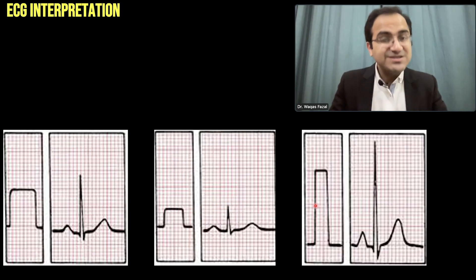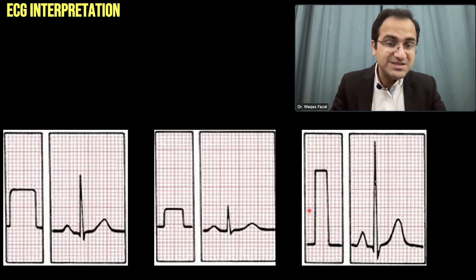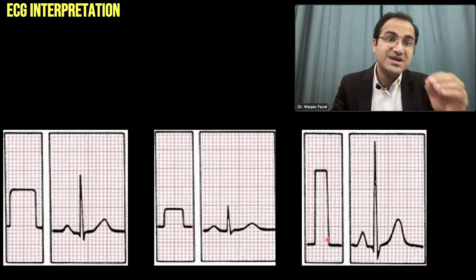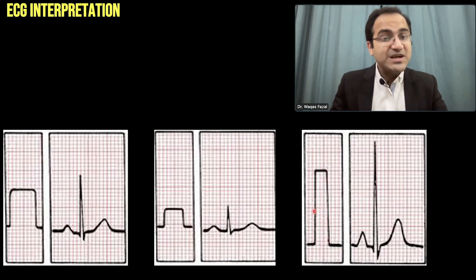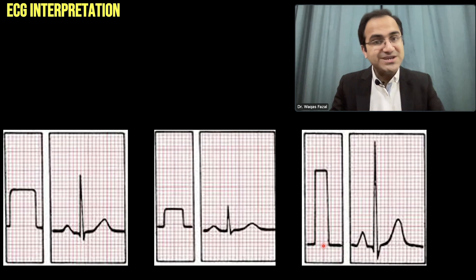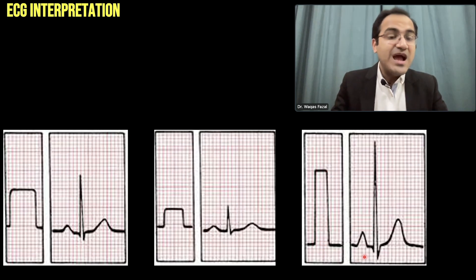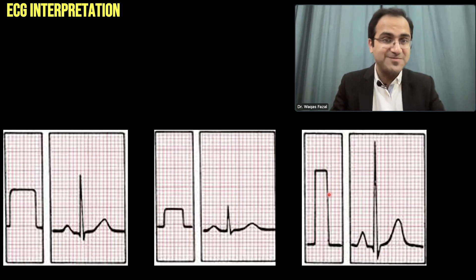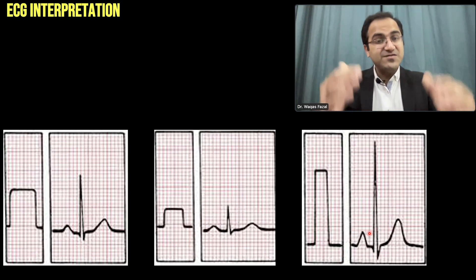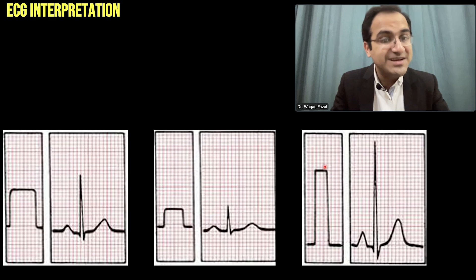Here is another example of non-standard calibration. In this one the height of the calibration box is four large boxes tall, and the width is half a large box — so the calibration is non-standard. When you increase the height, the amplitude doubles. Look at the QRS complex here — its size has doubled due to the increase in calibration height. Look at the P waves and QRS complexes: their heights have doubled up due to the increase in calibration height.